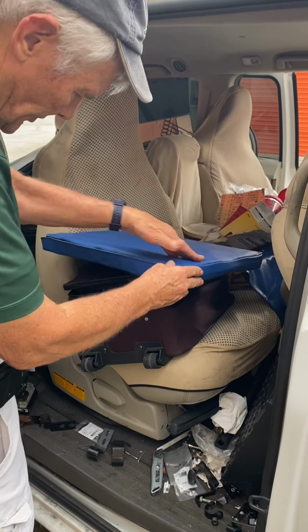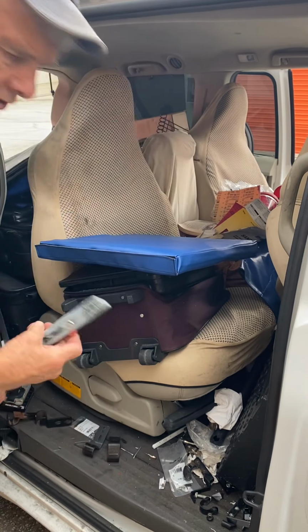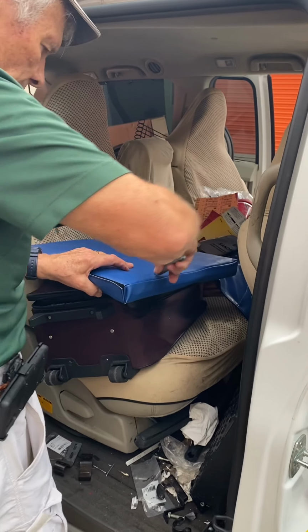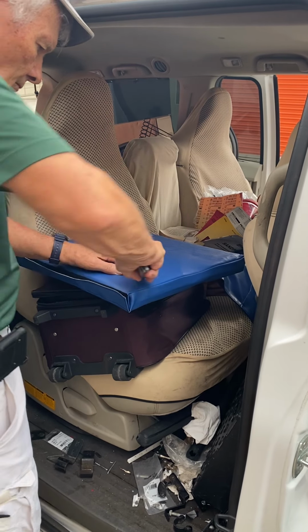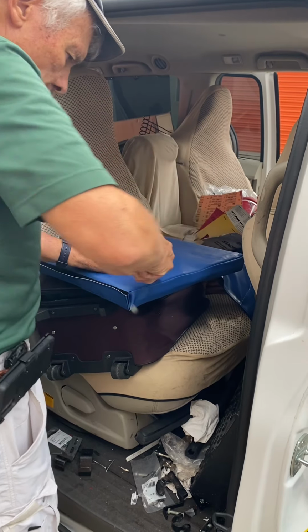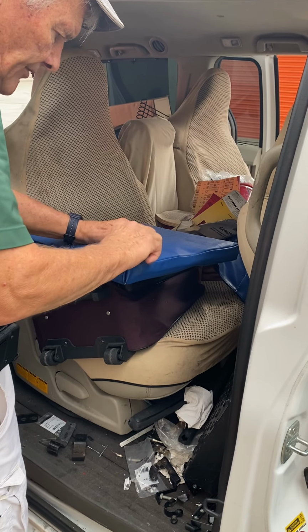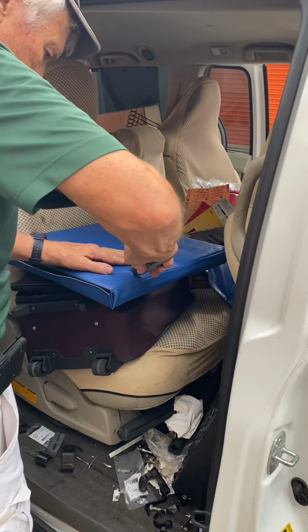Now you can feel the bumps where we left the screws in. We're going to use our cutter to cut around those, and cut them out, being very careful not to cut your finger off in the process.